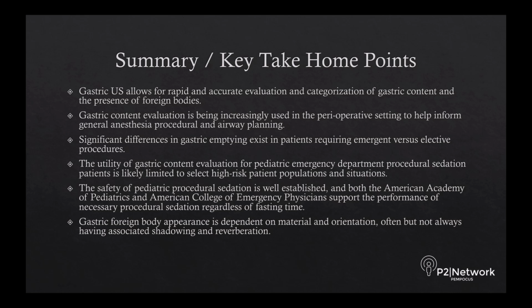populations and situations. In line with this, the safety of pediatric procedural sedation is well established, and both the American Academy of Pediatrics and American College of Emergency Physicians support the performance of necessary procedural sedation regardless of fasting time. And lastly, gastric foreign body appearance is dependent on material and orientation, often but not always having associated shadowing and reverberation.